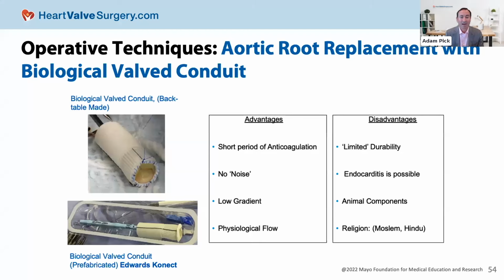Dr. Shrestha, I've got to ask the question. Here at HeartValveSurgery.com we talk a lot about the lifetime management of valve disease. And I know you shared that this prefabricated biological valve conduit could potentially last the lifetime of that patient. But I'm sure patients are wondering, we're living longer lives. If by chance we do need to have another operation, is this something that a valve-in-valve therapy could address?